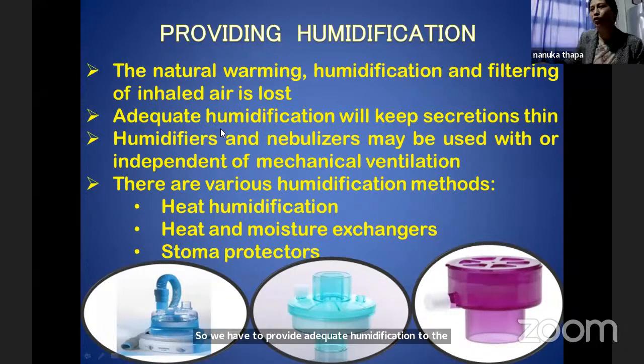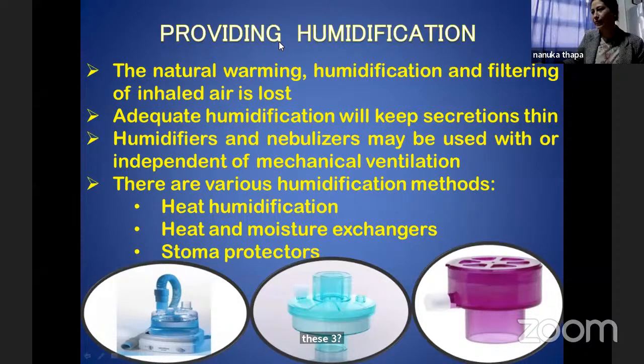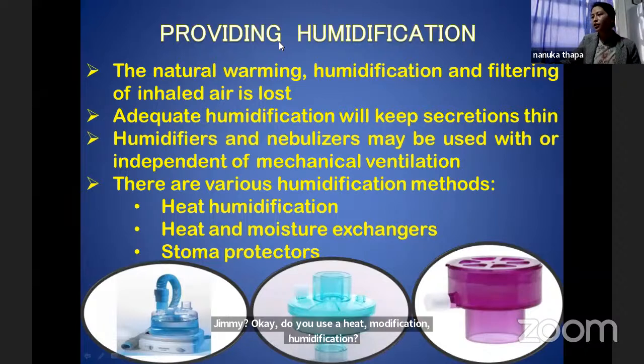Adequate humidification will keep secretions thin. A humidifier and nebulizer may be used with or independent of mechanical ventilation. These are the types of humidification mainly used: heat humidification in this first picture, then HME, that is heat and moisture exchanger, and the stoma protector. Which of these three do you mostly use? Can you give the answer? HME, okay. Do you use heat humidification? Okay, so mostly they use HME.